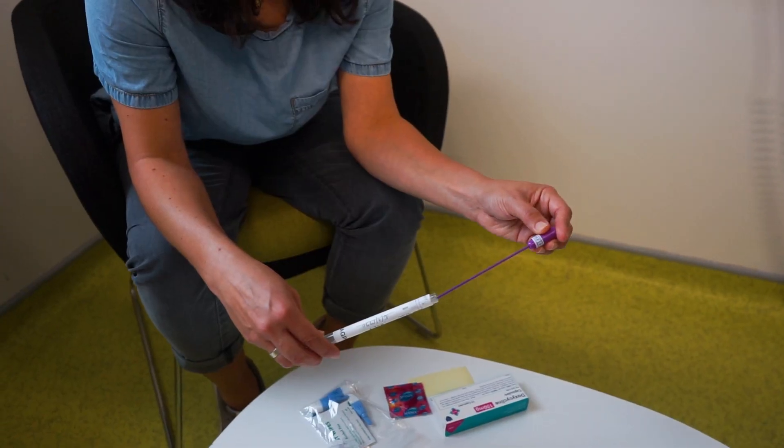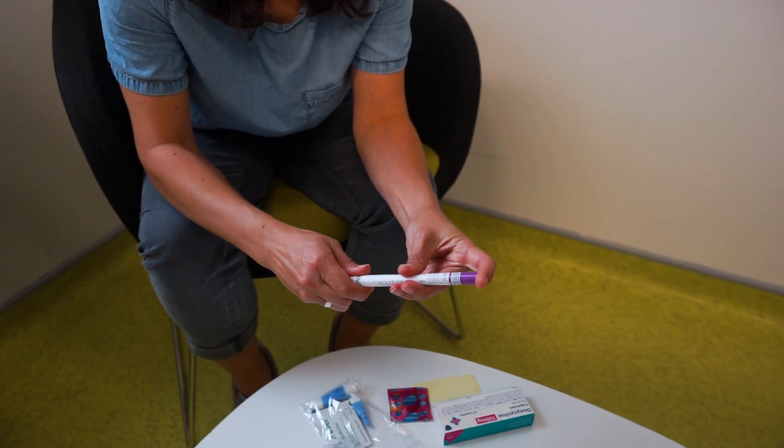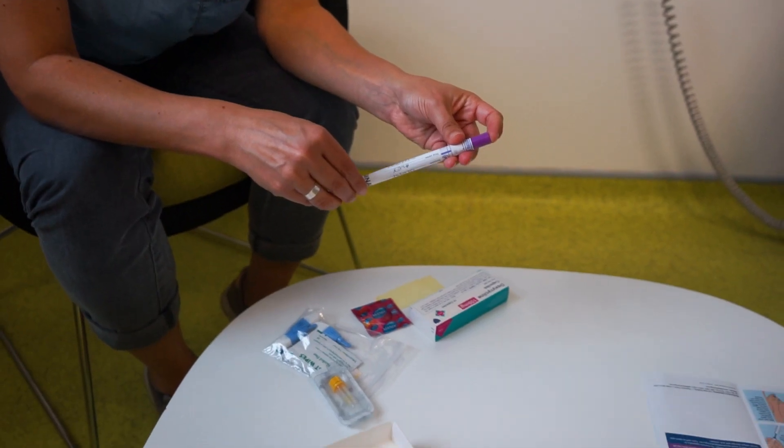Put the swab back into the bottle and firmly close the cap. Place the completed test request form and labelled sample into the white box.